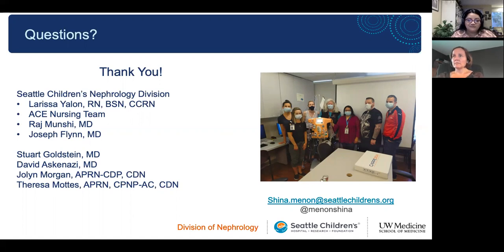So 4 times the normal clearance that we would provide. And for a 4-kilo baby, if you do the calculations, that comes up to be something like 1 liter per hour of replacement fluid, which is beyond the ability of Aquadex. So that would be the only situation where I would not use Aquadex for CVVH, but otherwise for most other patients, we are able to provide similar kind of clearance.